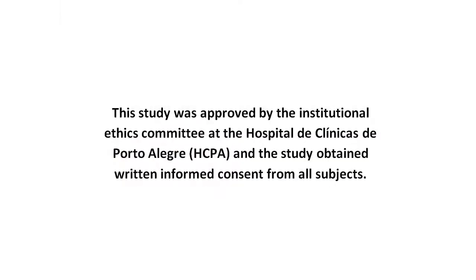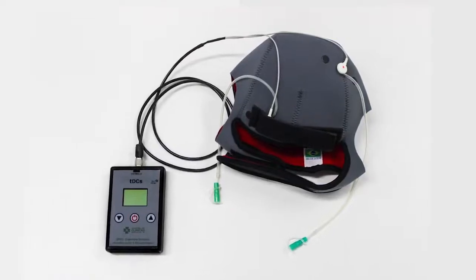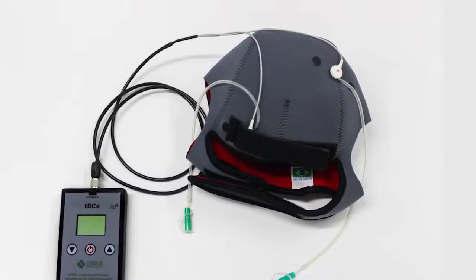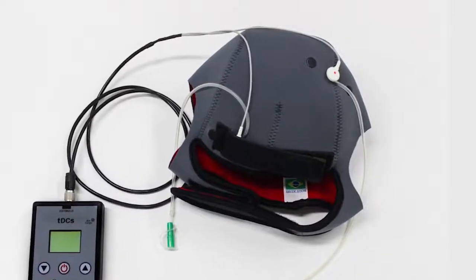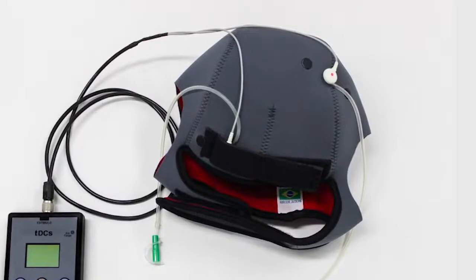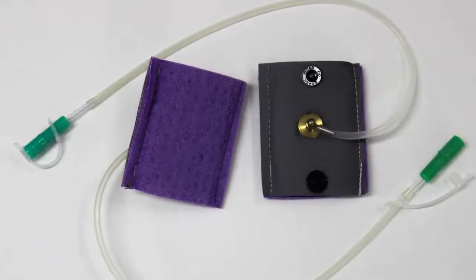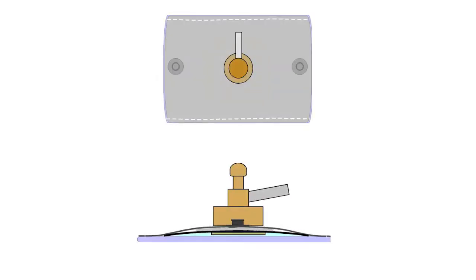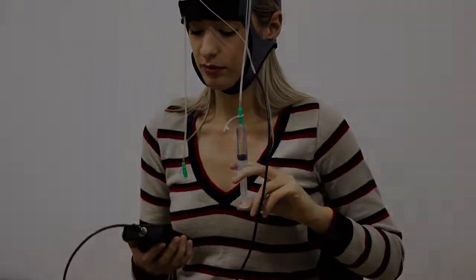To solve the difficulty of correct electrode placement without the help of another person, we created a neoprene cap that allows the use of two electrodes in any assembly and is fixed in the chosen place. To moisten the sponges, clear silicone probes were attached to the cap, connecting the field sponges and syringes to the saline solution. The cap allows for easy facility of use.